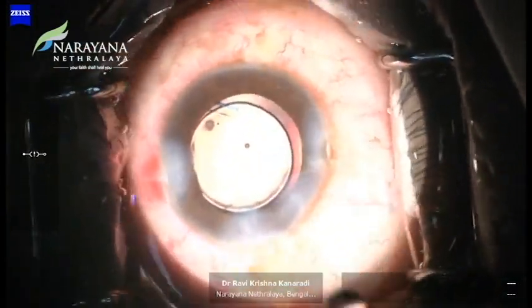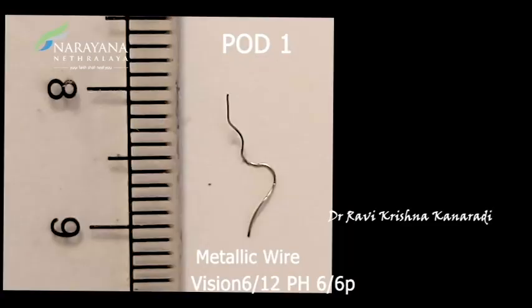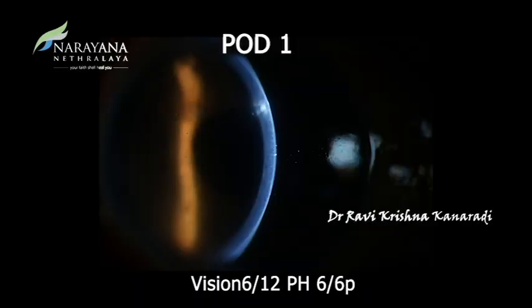We had a very happy patient improving to 6/6 with pinhole on post-operative day 1, a well-centred intraocular lens and minimal anterior chamber reaction.